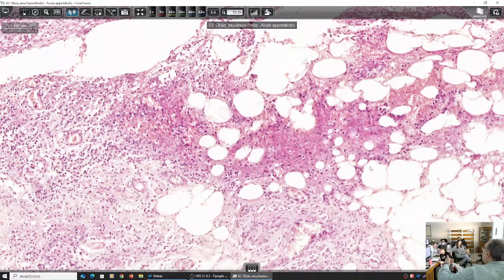Leukocytosis with neutrophilic type. That means you'll have an increased amount of leukocytes in the blood with a neutrophilic predominance. And this is consistent, taking into account the other symptoms, with acute inflammation of bacterial origin. So this is direct extension of the inflammatory infiltrate to the tissues.